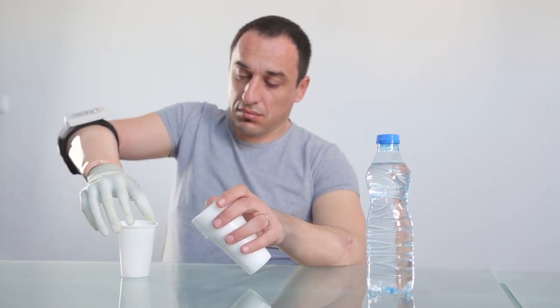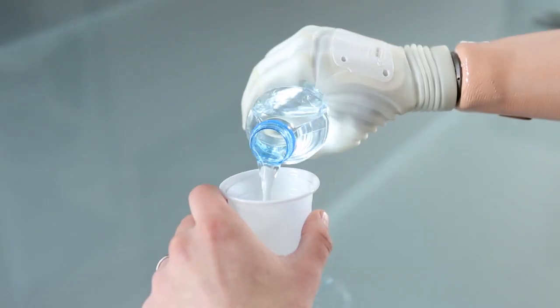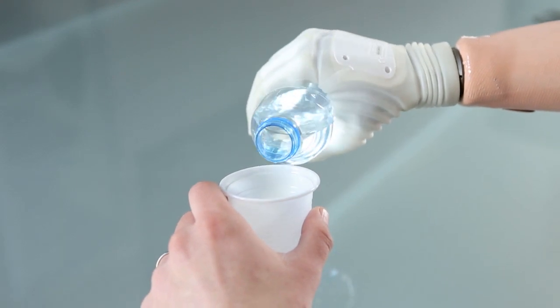The MaxHand system allows the wearer to control the pressure applied onto an object and to be aware of the state of the prosthesis without having to look at the hand.